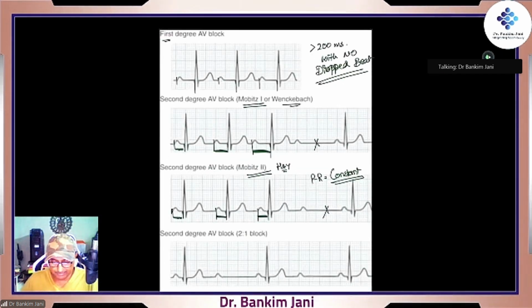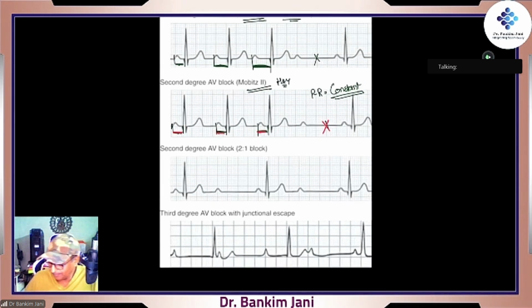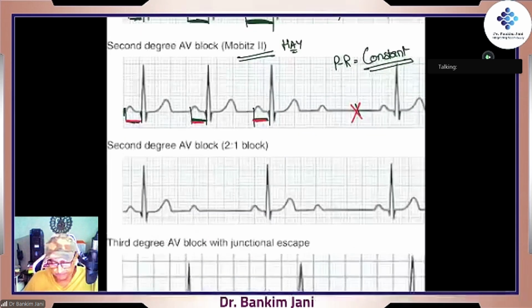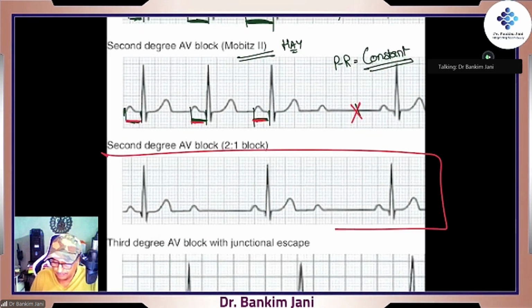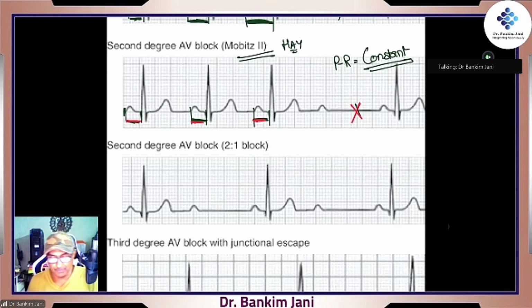So we saw this, right? That it is the same and the block. What type is this? You won't be able to differentiate whether it is Mobitz type 1 or 2 when the block is 2:1 block.